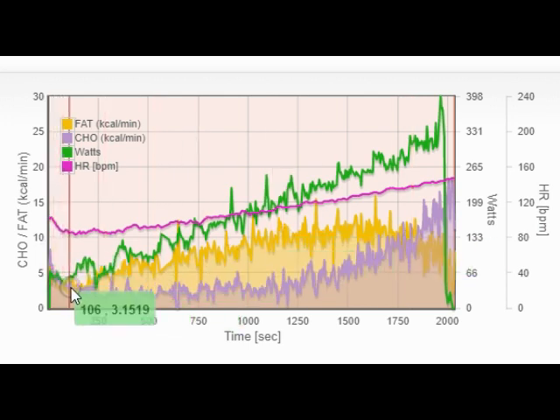You can see initially the purple down here, that's all sugar. And there's a little burst of sugar to cover the cost of movement in the very beginning. It's called a glycogen burst. It's a very real metabolic situation, and it's there on purpose. You're laying on the couch, you hear a boom, you jump up, that's covered by sugar.